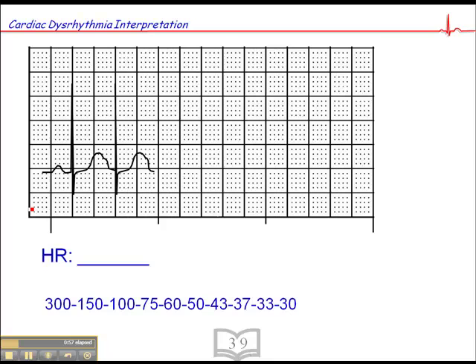So let's look at the first ECG. We find a QRS that falls on a dark line. If the next QRS fell one large square away, the heart rate would be 300, but it actually falls two large squares away, so that makes the heart rate 150.